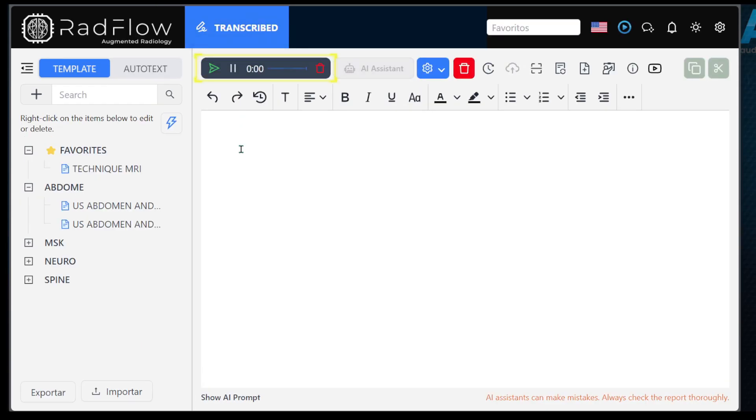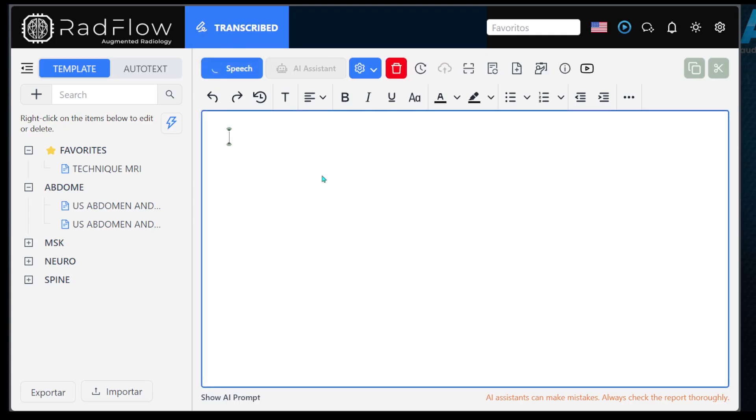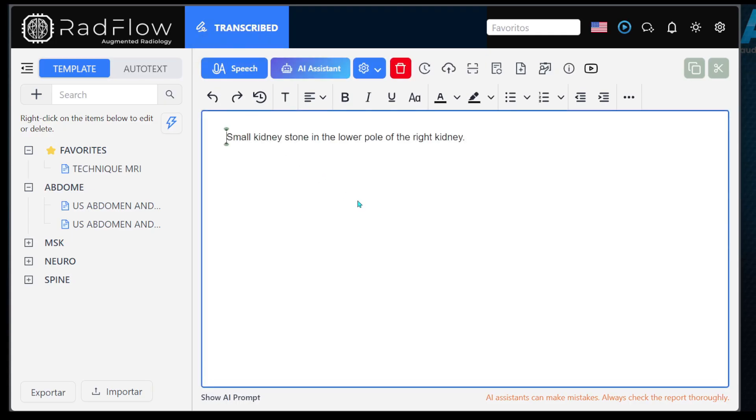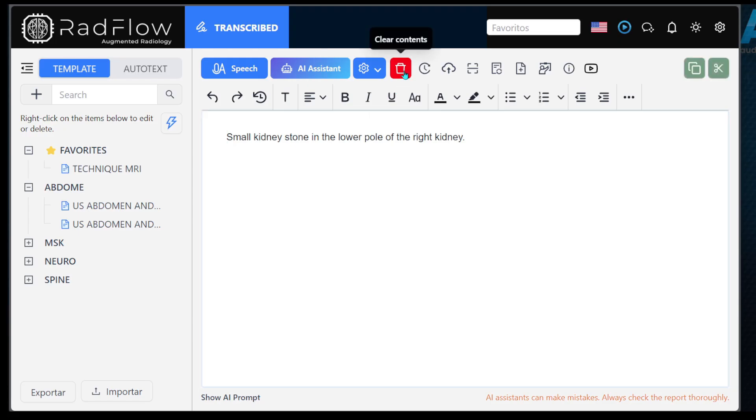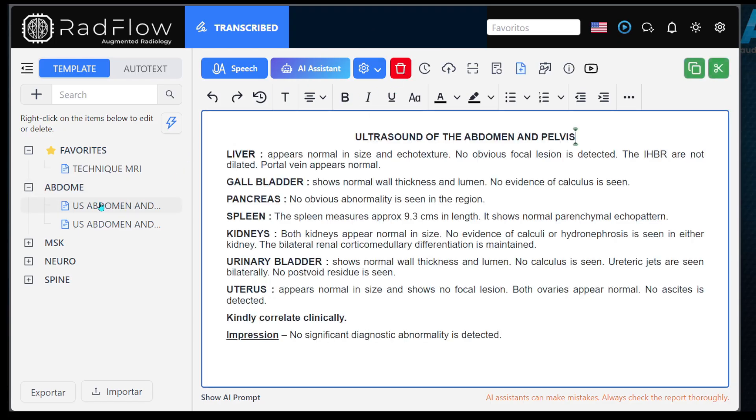Speech AI allows voice-to-text transcription using artificial intelligence but it does not consider the content already present in the editor. In other words, it simply transcribes what the user says without analyzing any existing text on the screen.